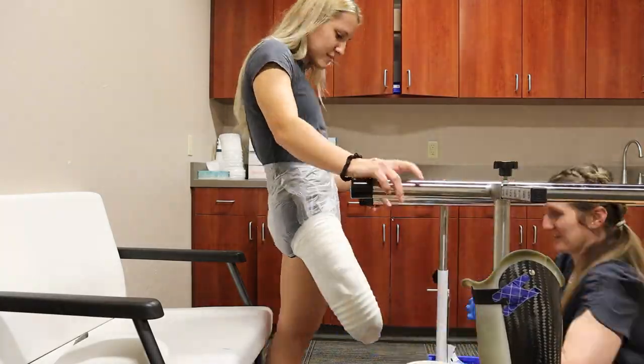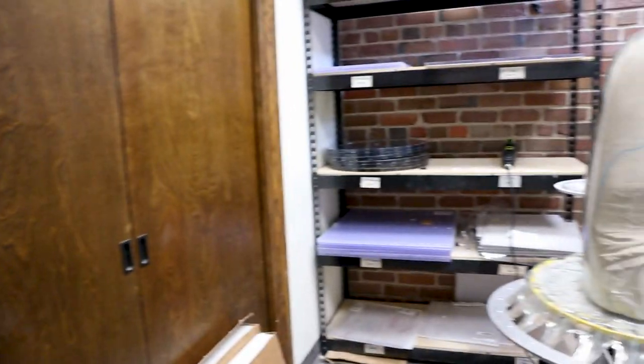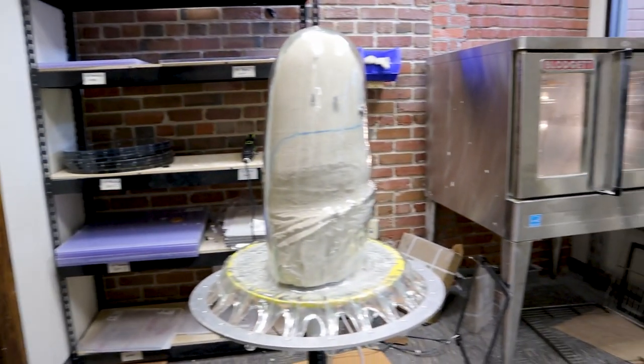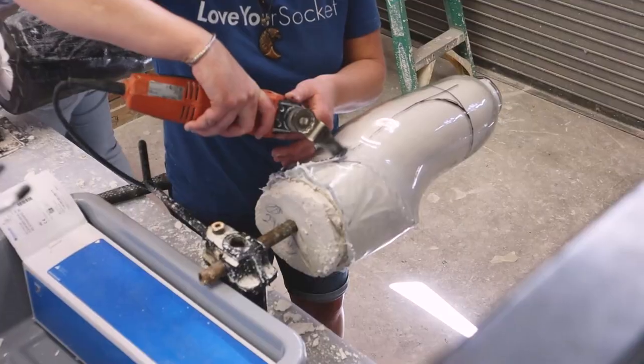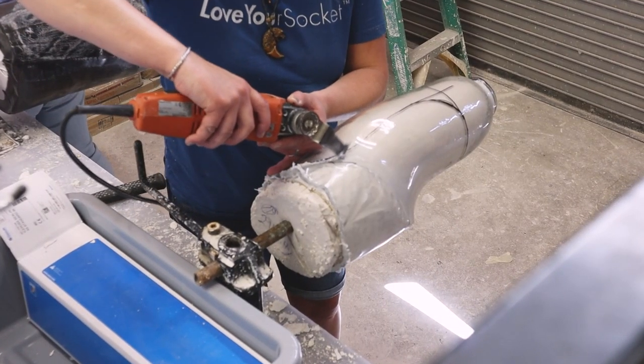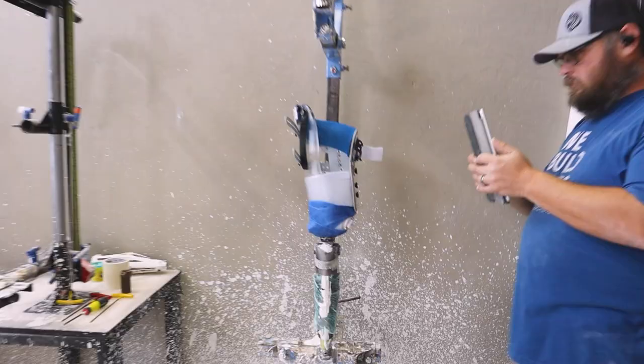As far as the experience of getting the socket made, it's not that different from a traditional socket — they still cast you the same, you still get a test socket and then your final socket. The time between each of them is a lot shorter than traditional sockets. It was just wham bam — the easiest socket I think I've ever had made.